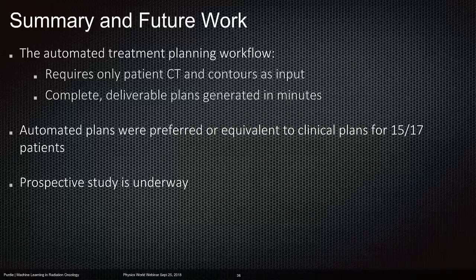And as Fredrik said, the bulk or the heavy lifting is done offline, while you're building the model. So that time, in effect, doesn't really matter. We're not going to be producing models every day, although we could build a new model every night. That would be completely feasible, I think.